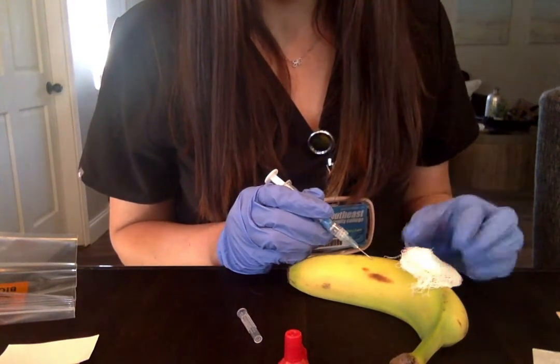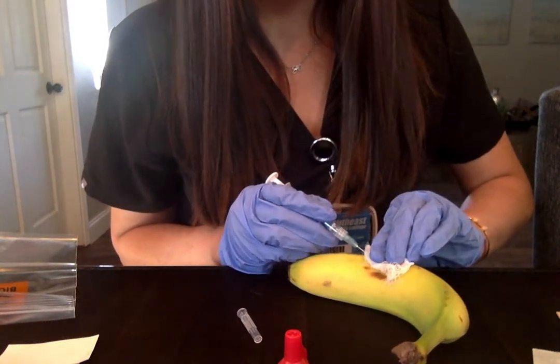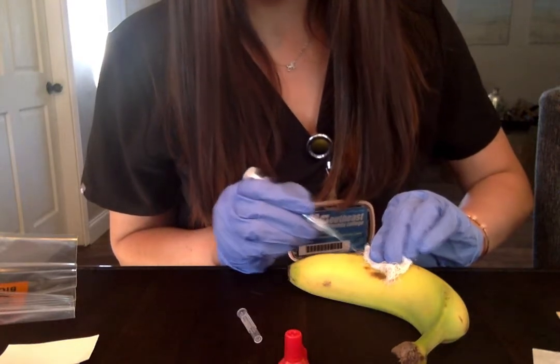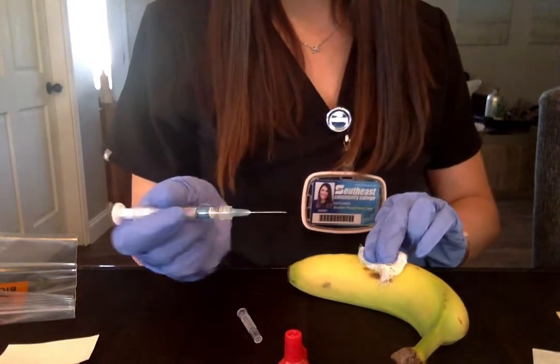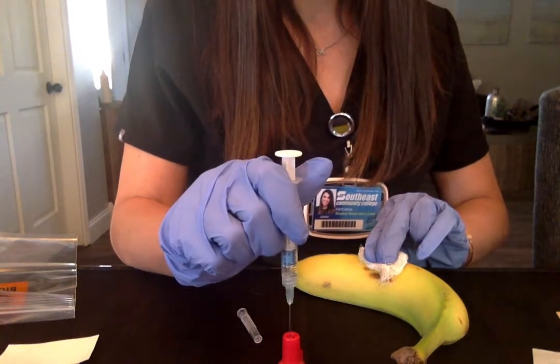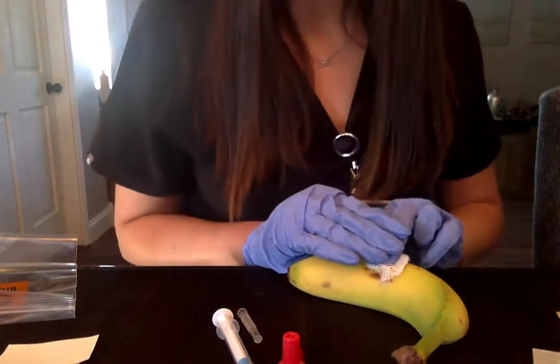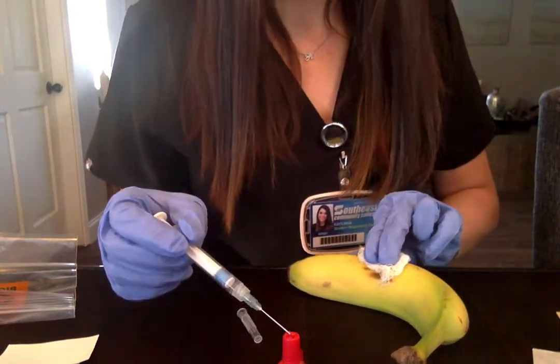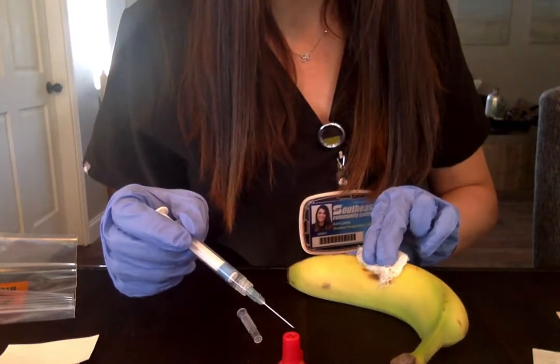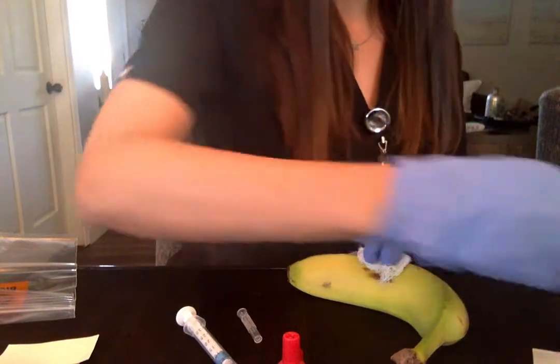Once that fills up, I'm going to grab the gauze, apply pressure, and then slowly pull this back out. While I'm pulling and holding pressure, I'm going to stick my needle and cork it — I'm not going to do that now because it'll get stuck. I'm just going to apply pressure for the correct amount of time for this patient, around three to five minutes, and then I would apply a band-aid.